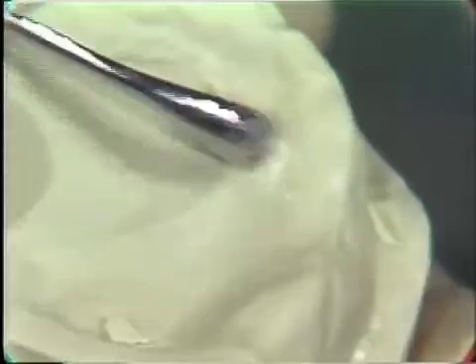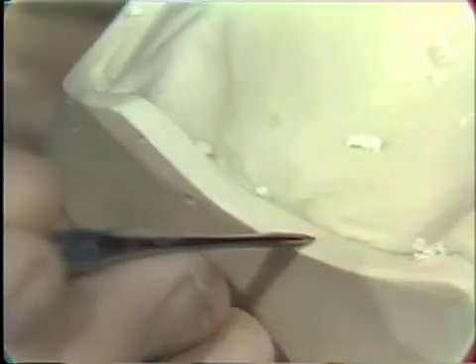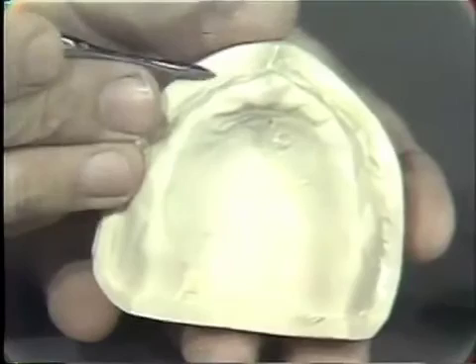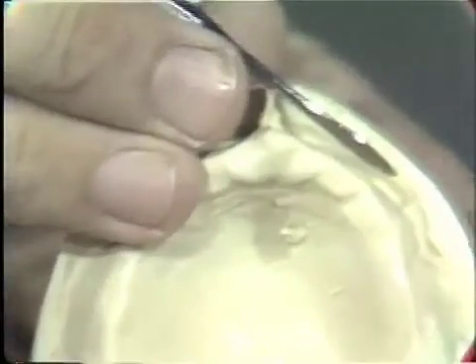This can be performed on the preliminary model because this is a working model and it will be used to make a tray. Imperfections of this nature on the maxillary cast would of necessity have to be removed. One should also note at this point that we have a landing area in this particular region, across the back part of the cast, and if we go to a wider shot, we can show that we have landing areas located in the labial region that are approximately an eighth of an inch to a quarter of an inch, and similarly over in this area here.